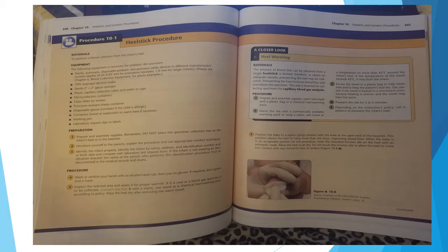Prepare and assemble supplies: warm wet towel and a plastic bag or a chemical heel warming pack. Warm the site with a commercially available warming pack or wrap a warm wet towel at a temperature no more than 42 degrees Celsius around the infant's foot. If the temperature of the towel exceeds 42 degrees Celsius, it may burn the infant.